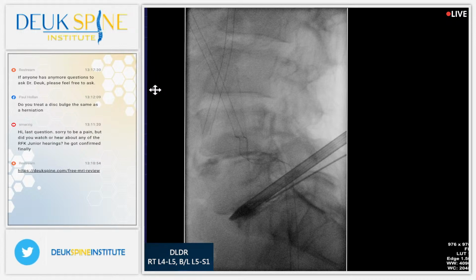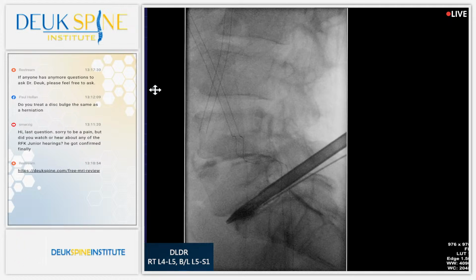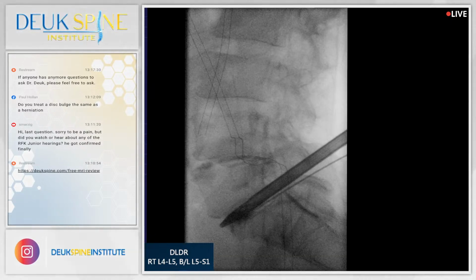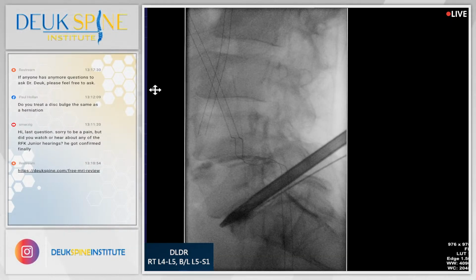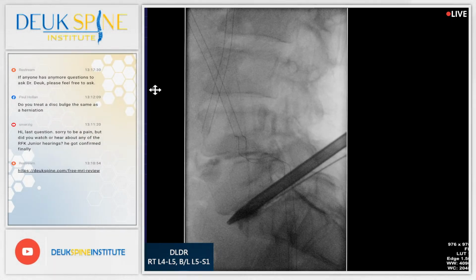But I think we're all right. Thank you, Luis. Shot. Keep an eye on that tip. Where's the tube, you think? All right, that's good. Let's bring it out slowly and just double check it.